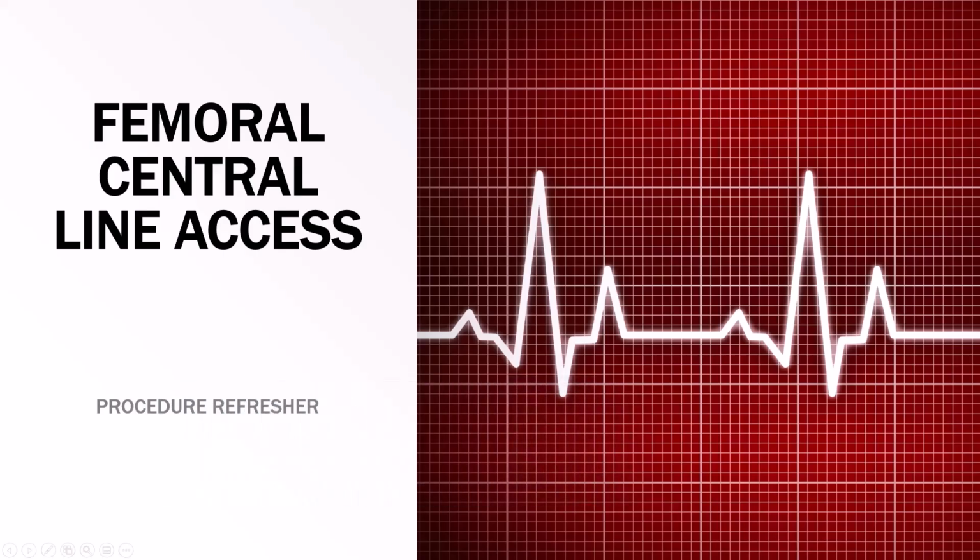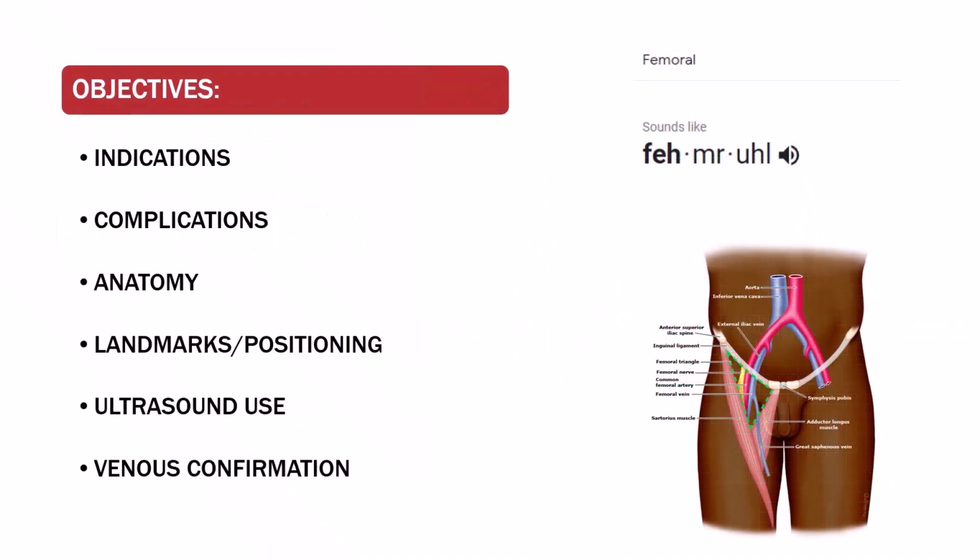Welcome to a procedure refresher on femoral central line access. Objectives of this session will include indications, complications, and anatomy of femoral line insertion. We'll also explore landmarks and positioning, ultrasound utilization, and the importance of venous line confirmation.